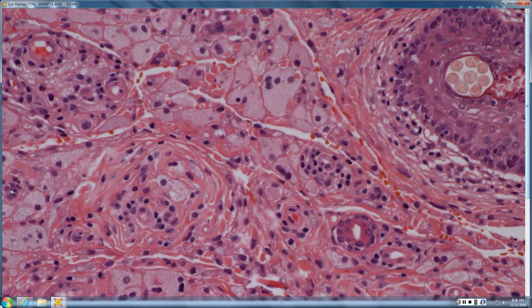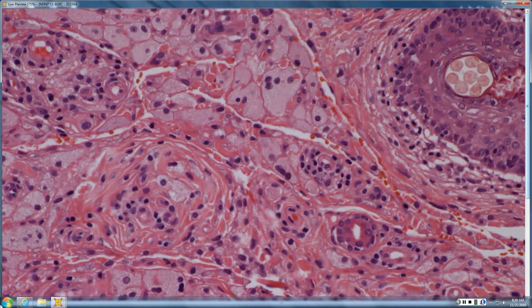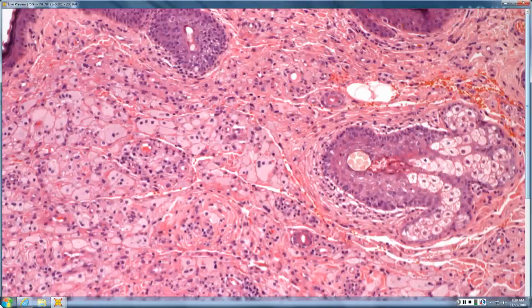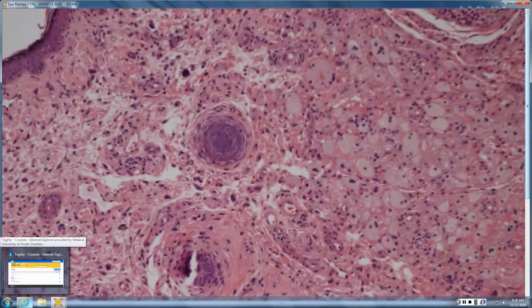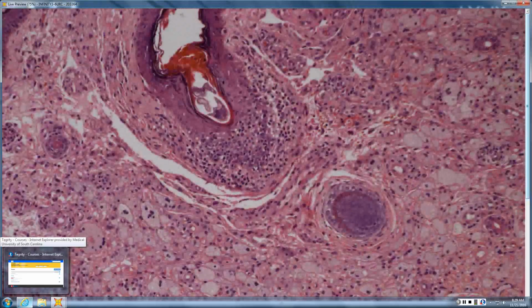I don't think that's true. So these are grayer; granular cell tumors are more Barbie pink. These are grayer, and it's on thin, delicate facial, probably eyelid skin. So I agree with you, that is xanthelasma.